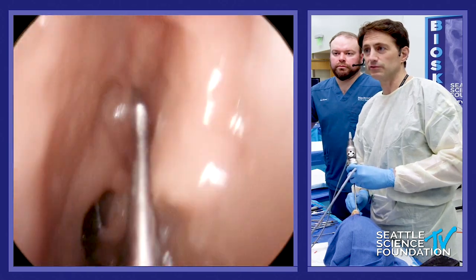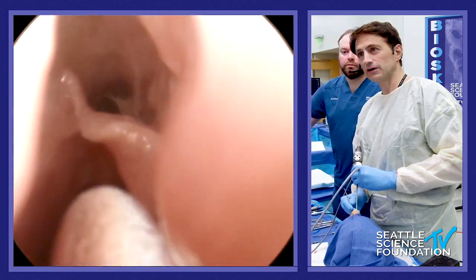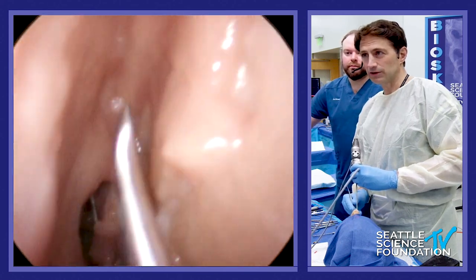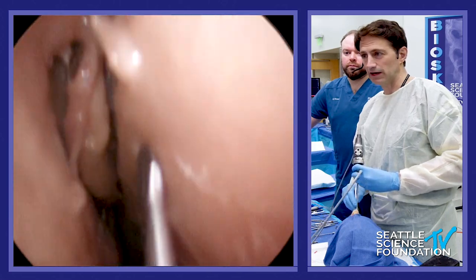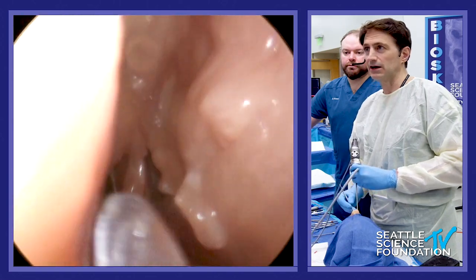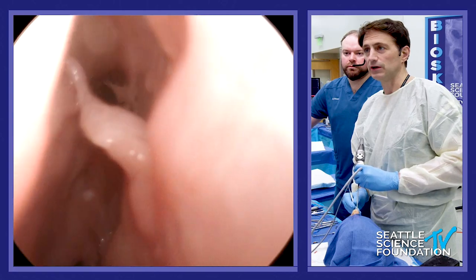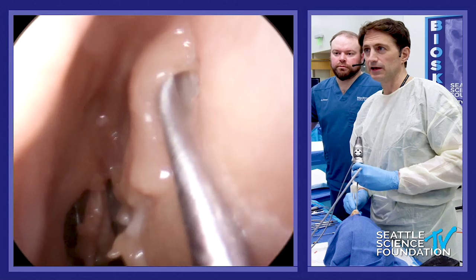It's something I've perfected over the years and the problem always is this area right here — this is the thinnest portion of the flap and so it's the most likely to tear. When you first start this you can try it, and if it tears that's okay. You just use the lateral base flap and you can use this as a free graft, or take the back portion of the turbinate here, thin it out, and use that as grafting over the exposed bone once you've drilled it out.